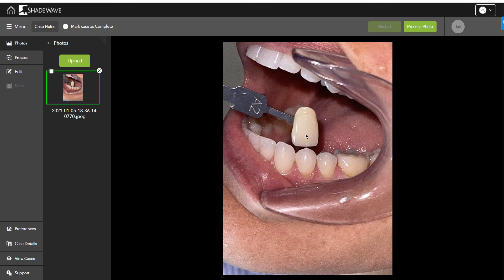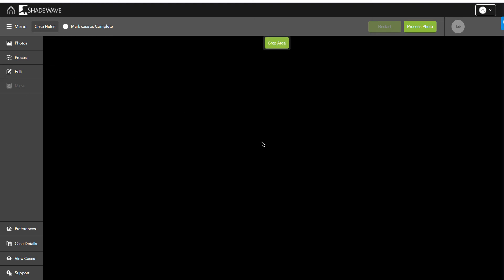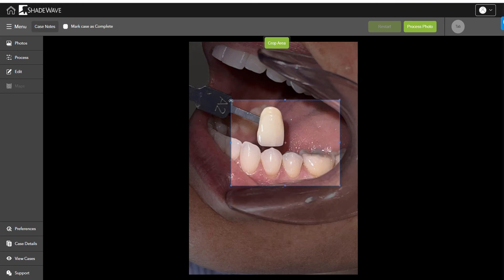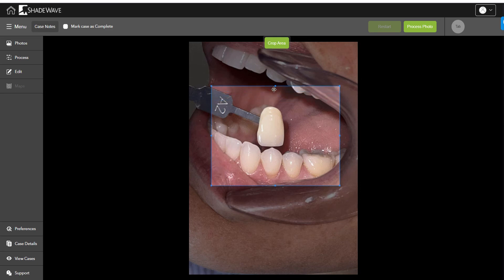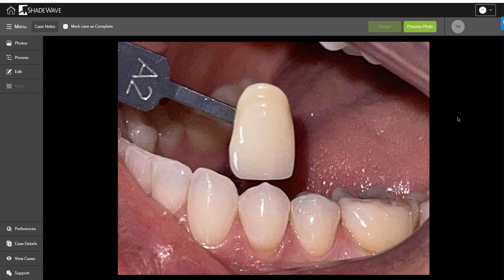Let's go through the process. First, go to edit, then crop, and adjust the cropping tool to include all the teeth. Make sure we include the A2 shade tab, then double-click to apply the crop. Now we can see the A2 shade tab and the tooth, and you can see the translucency in the upper part.